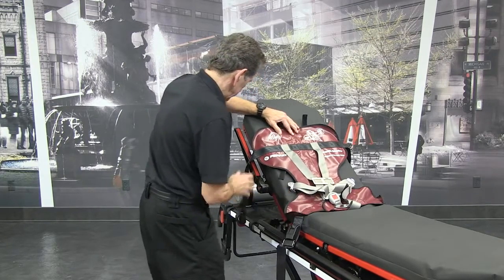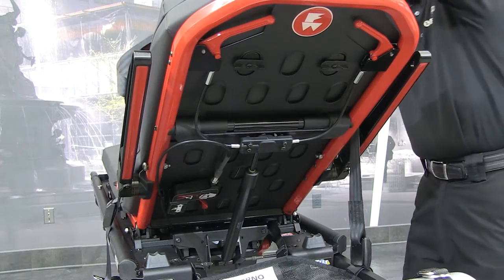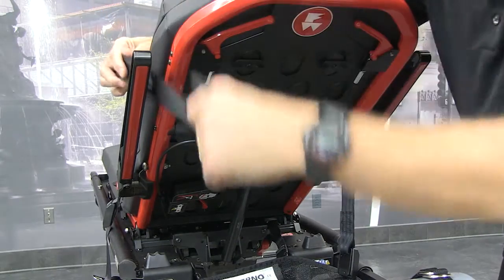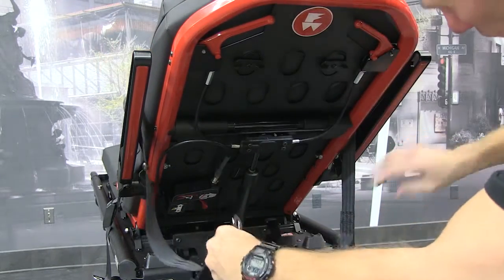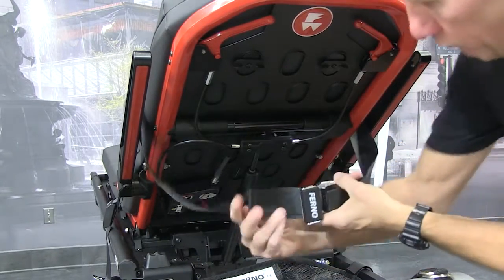Run the ends of the backrest strap around the cot backrest until they meet in the back, and then fasten the buckle. Leave some slack in the strap for final adjustment.